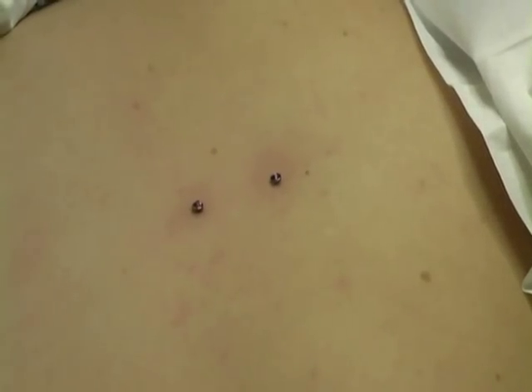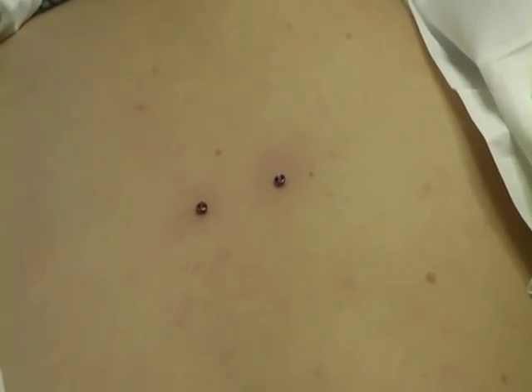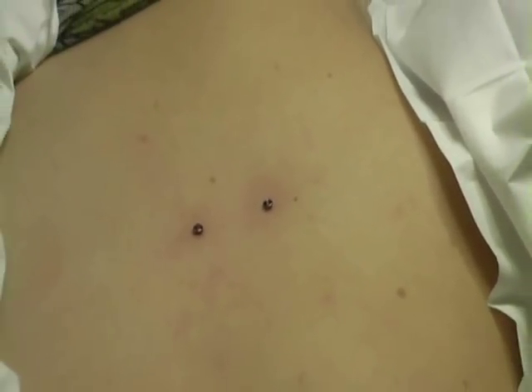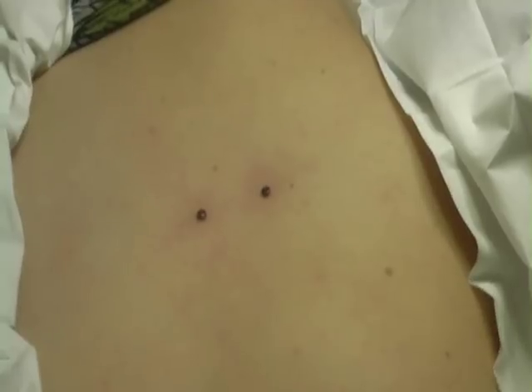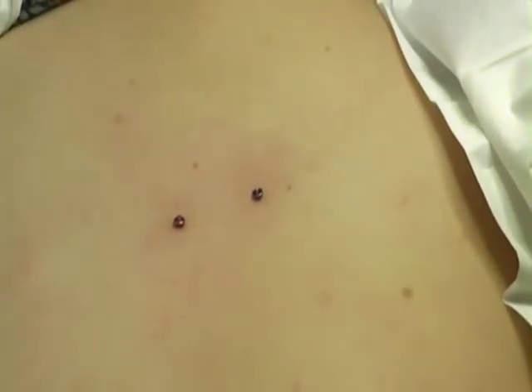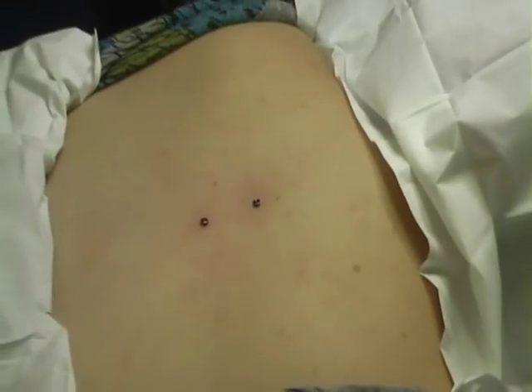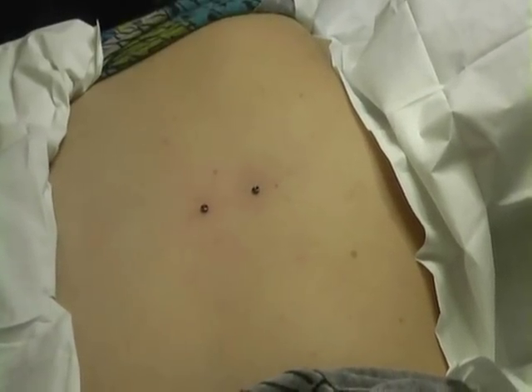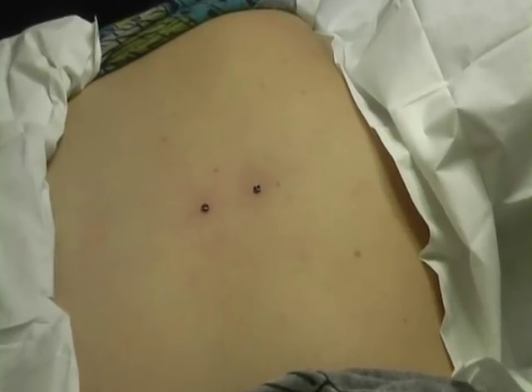Here we have Zoe, who about a year ago had a couple of body piercings put in. Just to put it into context, here is her spine down here with her shoulder blades here and here. There's a little foot plate underneath the skin, and then a hole through the skin to which the outside part is attached to the plate that's under the skin.